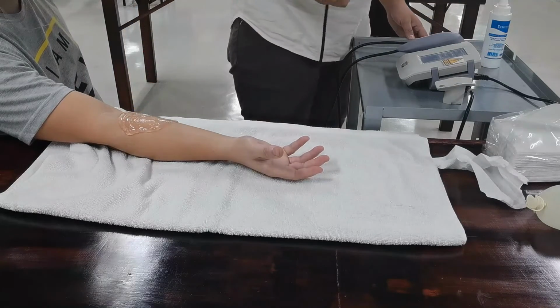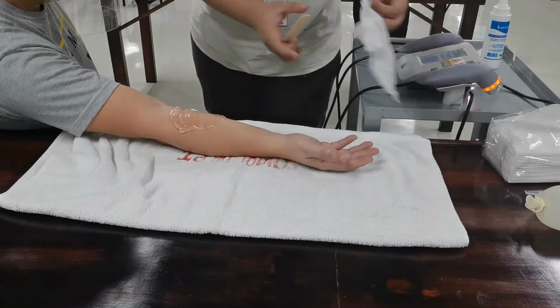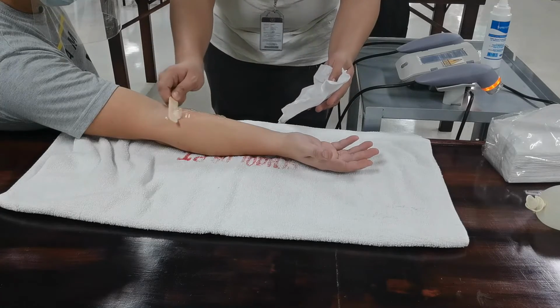So for example, the treatment is done. So you perform aftercare. That's the tongue depressor and the tissue.